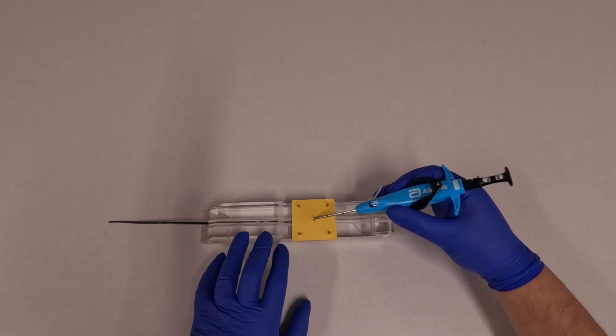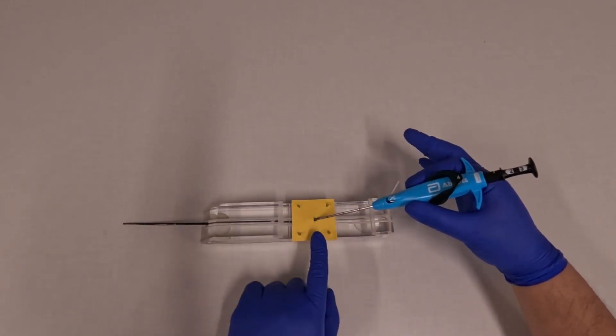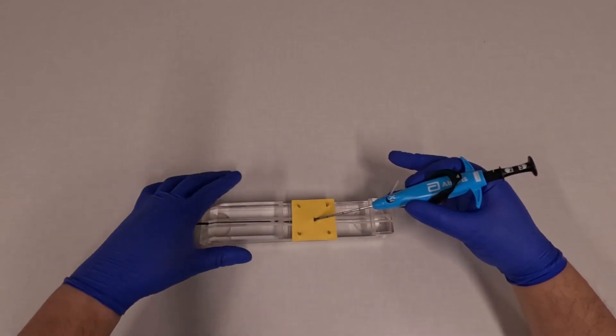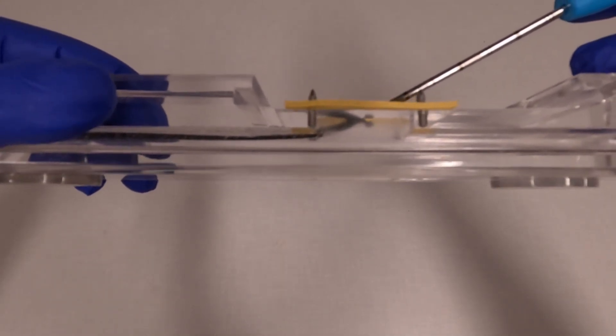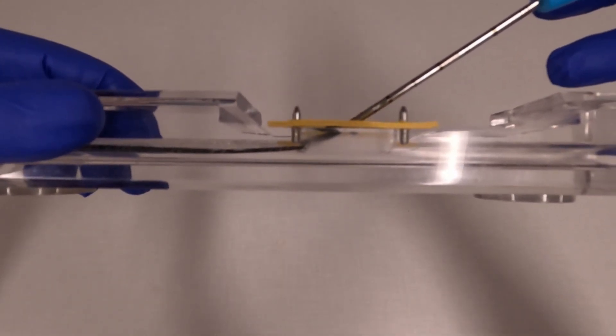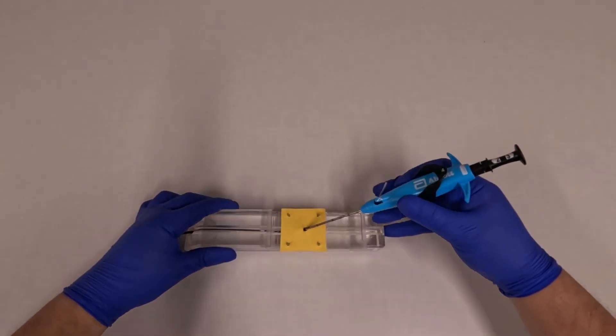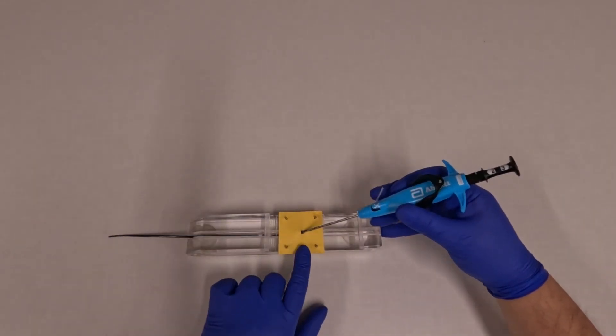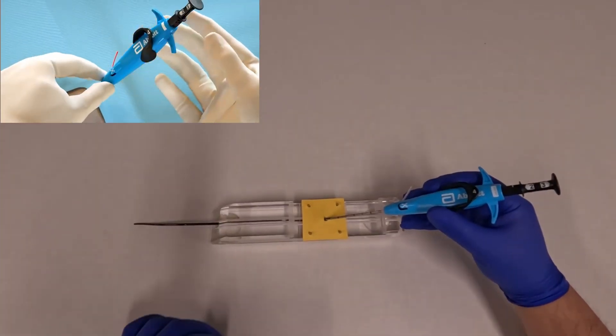Next, you're going to pull back very slightly on the device until the footplate abuts against the inside of the lumen. You can see here that the footplate has moved up and it's just inside the arteriotomy now. At this point you're going to maintain pressure holding the device at that angle about 45 degrees.